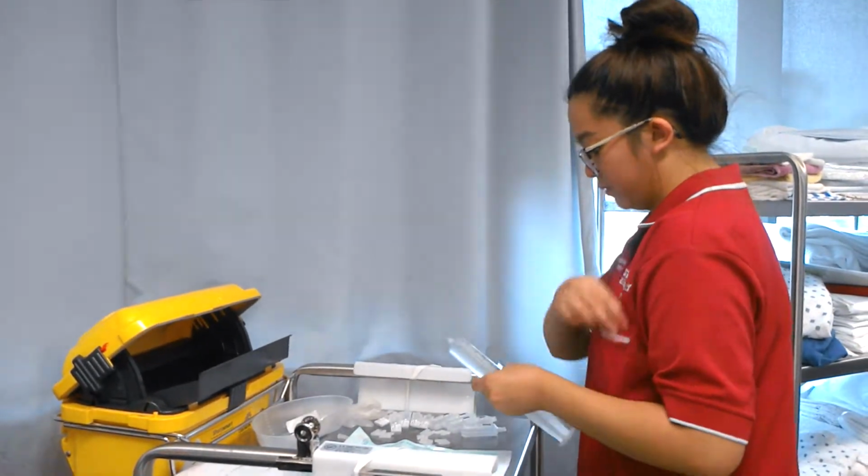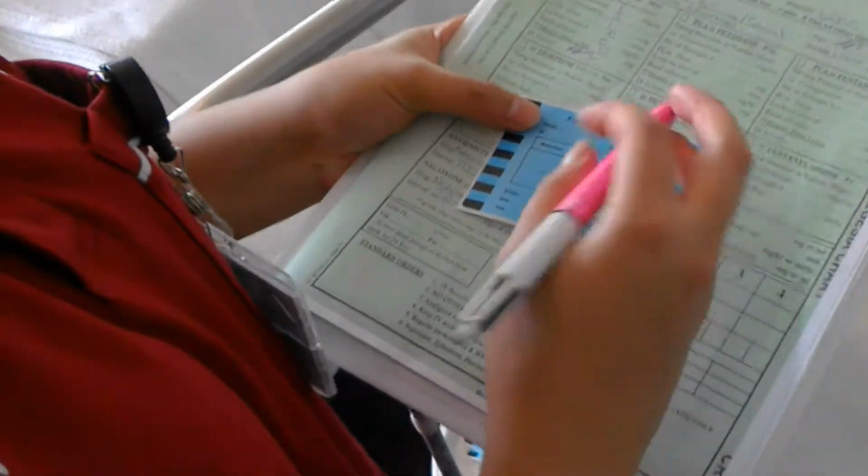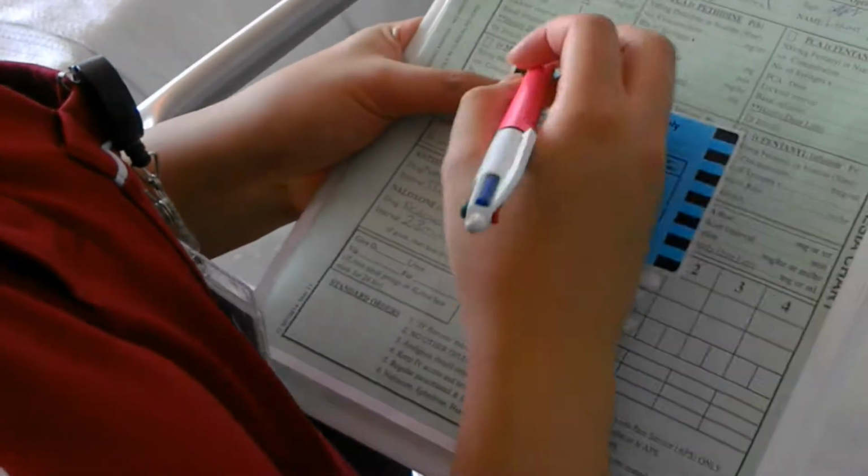Now, I'll just complete my fluid additive label to attach to the medication. So I'll just write down the name.